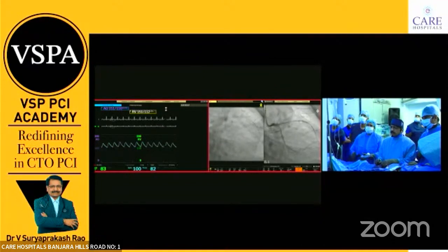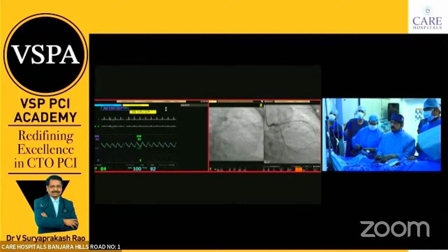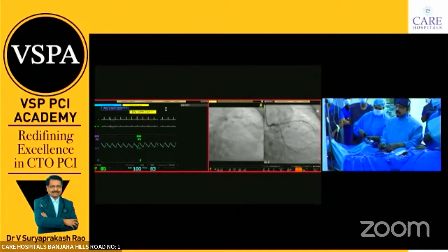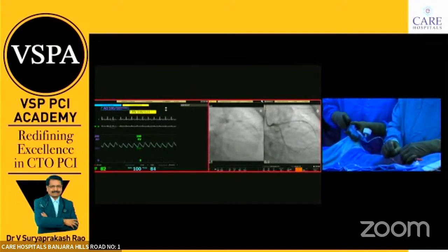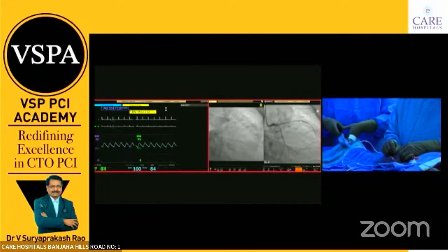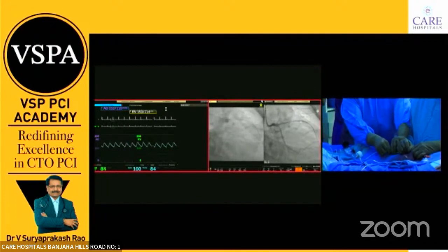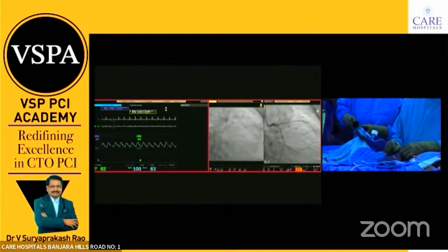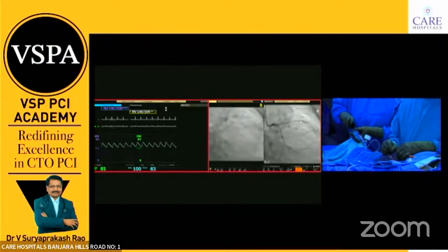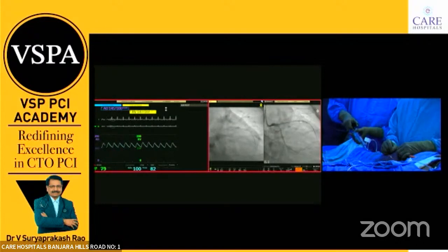That's the overlap actually, and do it there. 10, 12, 14, 16. Yes, this. Do it here. 20, 22, 24.